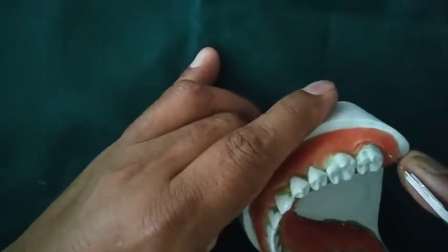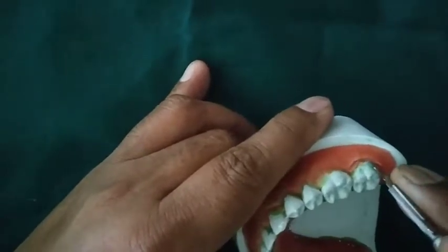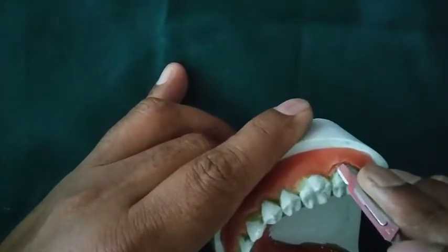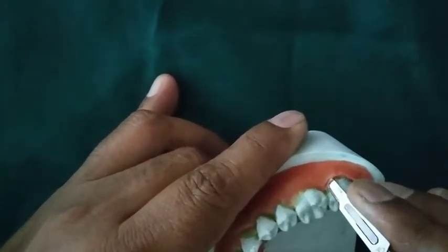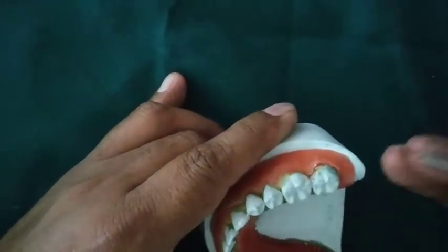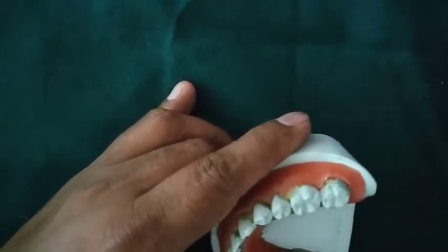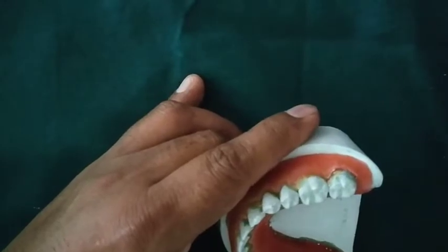I will now start the crevicular incision. You can note I am passing the blade from the distal to the mesial aspect along the gingival crevice. Now the periodontal flap is raised and we give the third incision using the interdental knife. This finishes today's tutorial. Thank you.